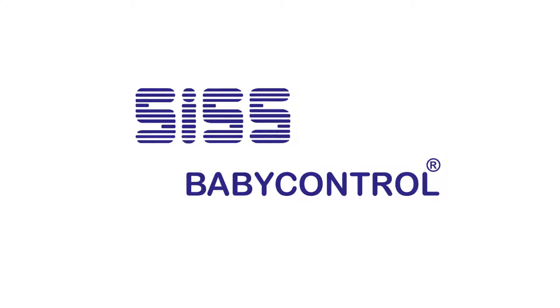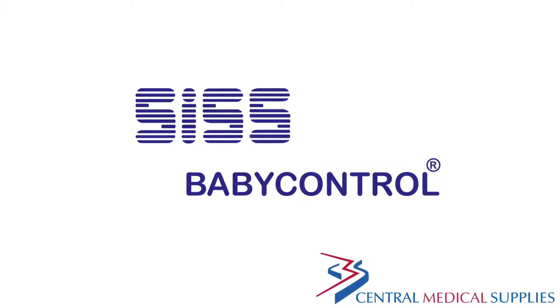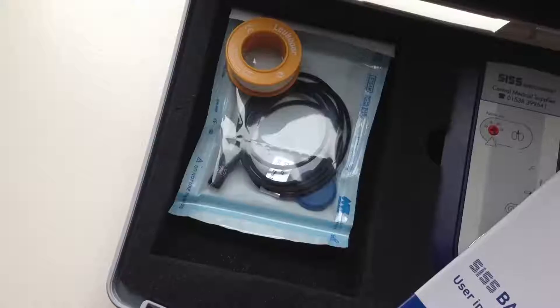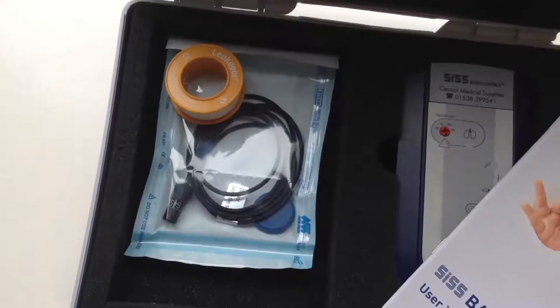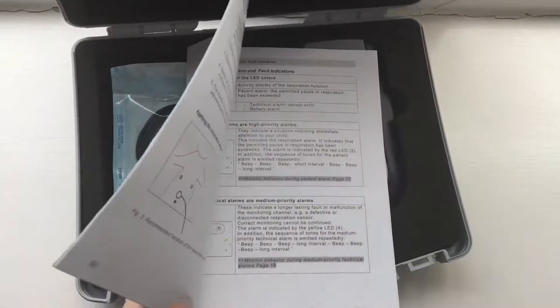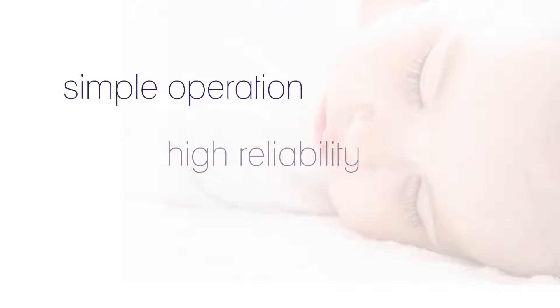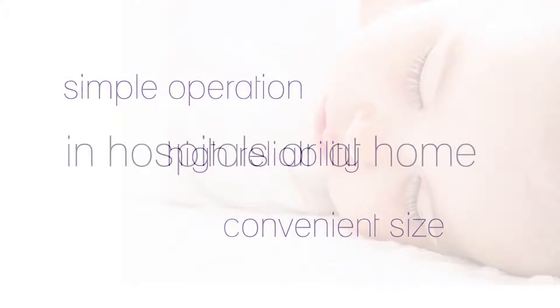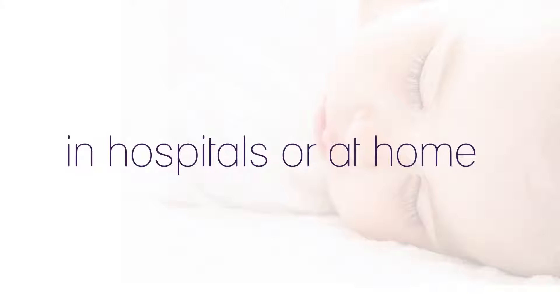The SIS Baby Control monitors the respiration of babies and infants, alarming if respirations cease. The monitor comes with all the parts needed to reliably monitor baby. Included is a set of user instructions featuring all details. The simple operation, high reliability and convenient size make the SIS Baby Control monitor an applicable instrument for baby monitoring in hospitals or at home.